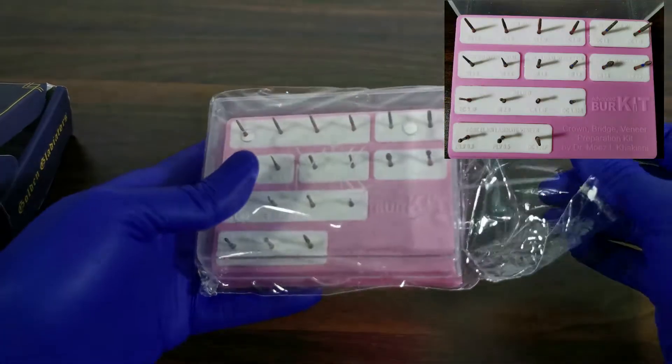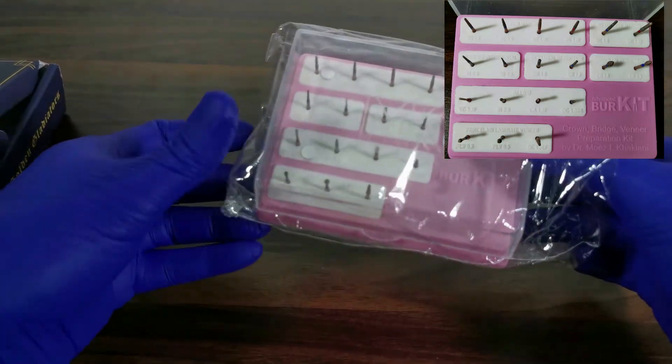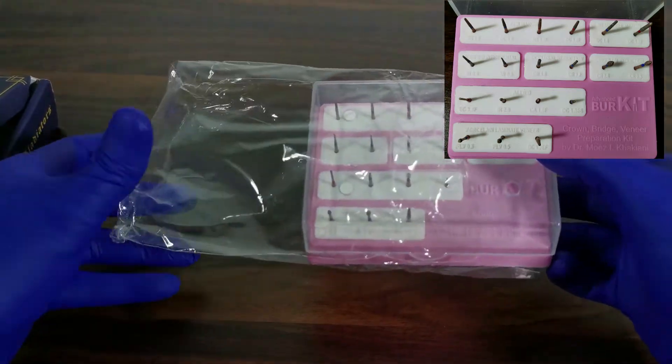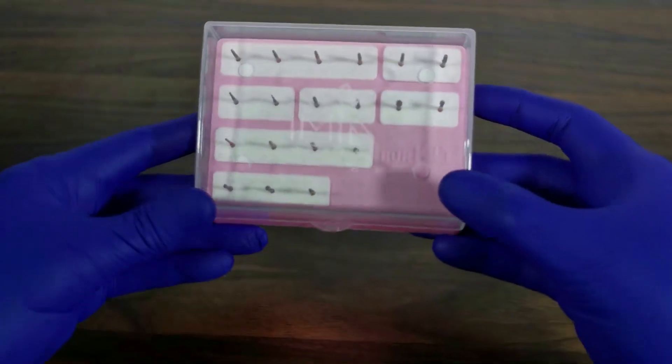The 19 gold series burrs in this kit are strategically divided into 7 clusters, each designed for a specific prosthetic material purpose.